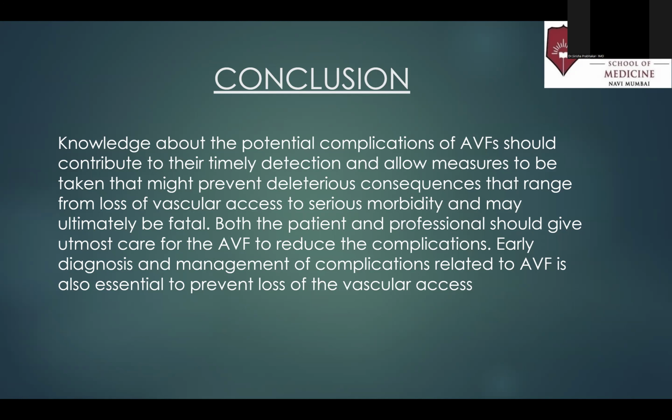So, knowledge about these complications should contribute to the timely detection and allow measures to be taken that might prevent consequences that range from loss of vascular access to serious morbidity and may ultimately be fatal. Both the patient and professional should give utmost care for the AV fistula to reduce the complication. We need to remember one thing while we are assessing patients with AV fistula: the AV fistula is the patient's lifeline, and our job is to keep it flowing.